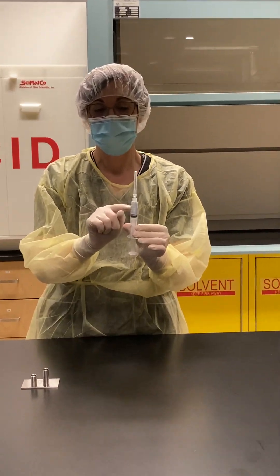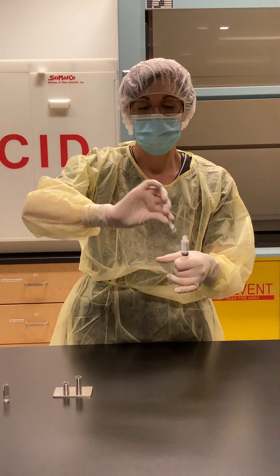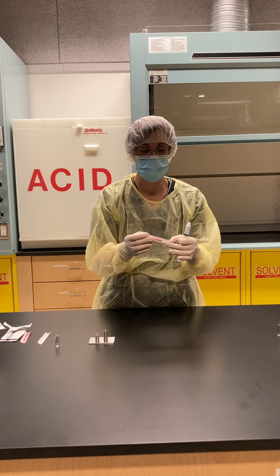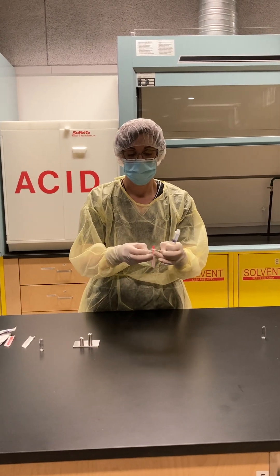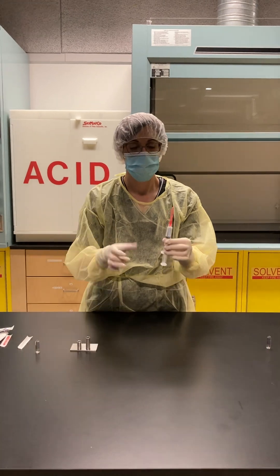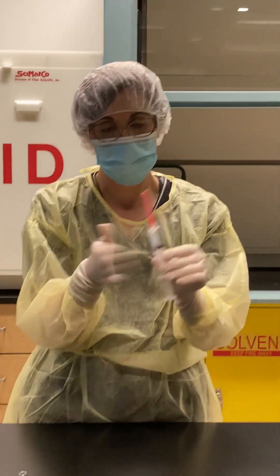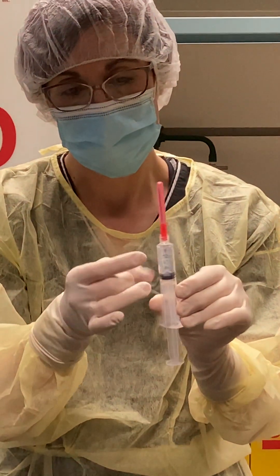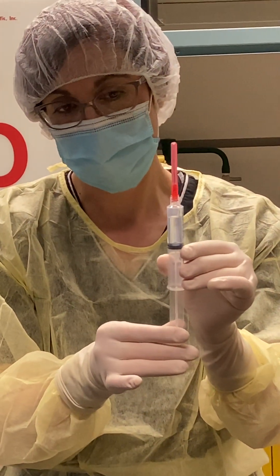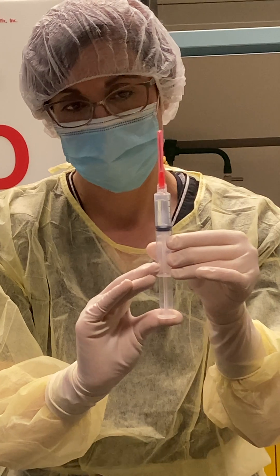To remove the air and to check my volume, I'm going to remove my filter needle and attach a regular needle to my syringe. Now I'm going to tap my syringe to bring all the bubbles up to the surface, draw in a bit of air, and just push up.